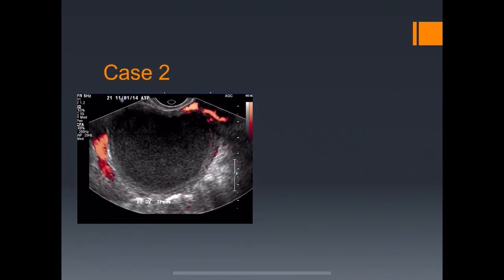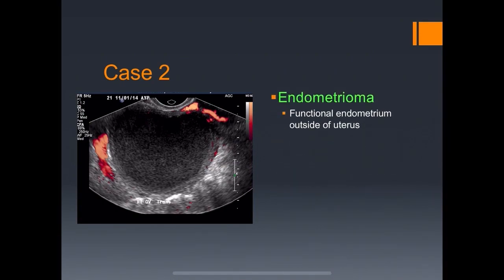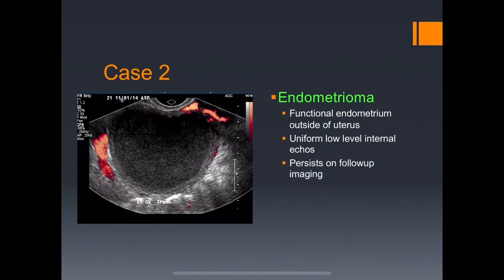Case two: as opposed to the prior, this cyst has low-level echoes. This is typical of an endometrioma — functional endometrium outside of the uterus with uniform low-level internal echoes. It persists on follow-up imaging unlike a hemorrhagic cyst, 50% are bilateral, and it can lead to ovarian torsion.